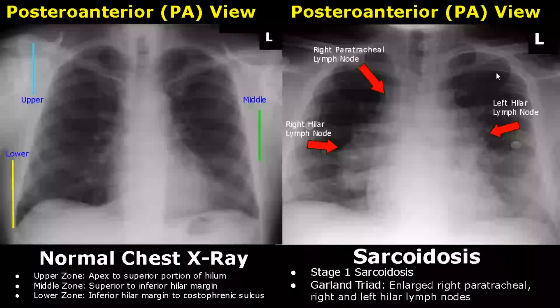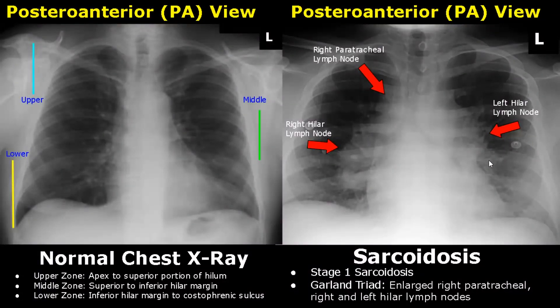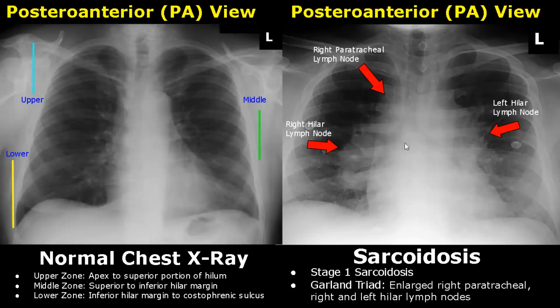In patients with sarcoidosis, pulmonary involvement is common. It has 5 stages from 0 to 4. In stage 0, the x-ray is normal. In stage 1, it has a specific feature called the garland triad, which has an enlarged right paratracheal lymph node and also enlarged right and left hilar lymph nodes. These enlarged lymph nodes will not connect with the cardiac silhouette — we can see the cardiac contours and they are not intermixed with the hilar lymph node opacities.